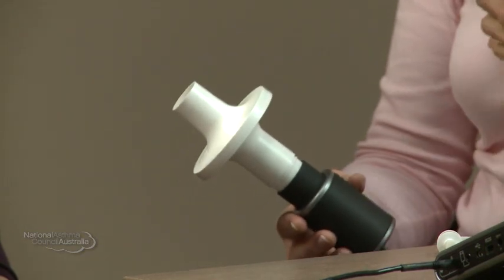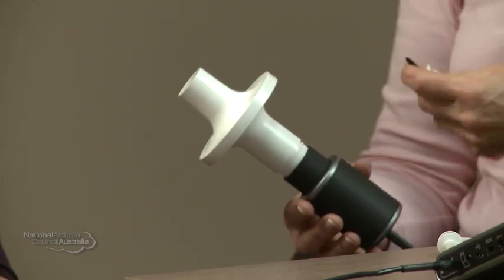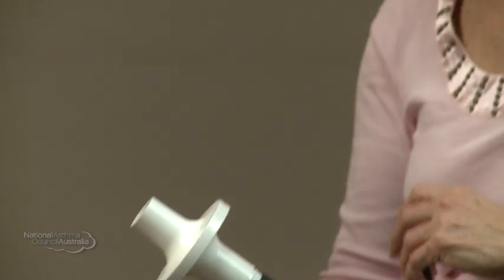I'll ask you to have a really big breath in, pop the mouthpiece in, and then blow out with all your might as hard and fast as you possibly can for as long as you can. Then I'll ask you, still with the mouthpiece, to have a big breath in. I have criteria that I have to meet to ensure that we're going to get accurate results. We'll need to do at least three blows, and as long as I've got two blows that are repeatable or consistent with each other, we'll be able to accept those results.